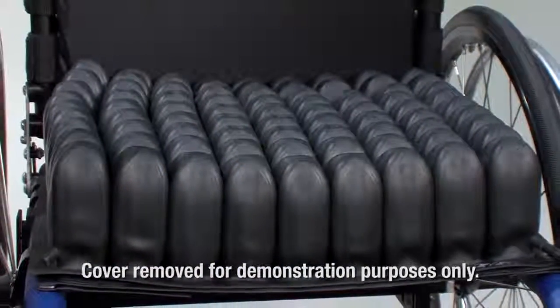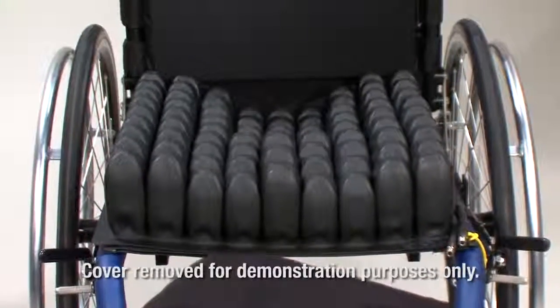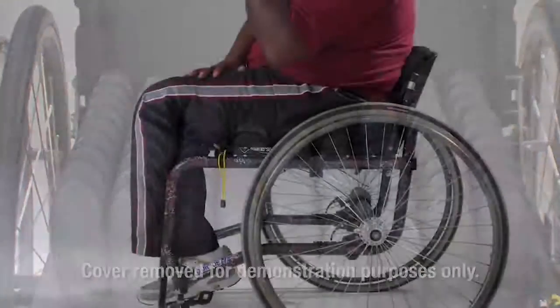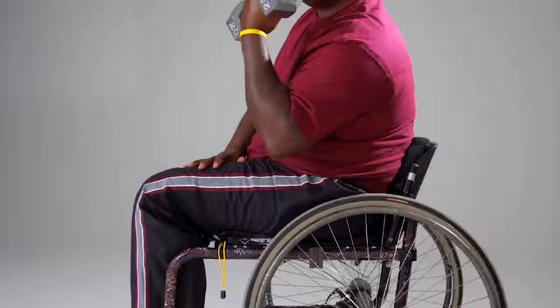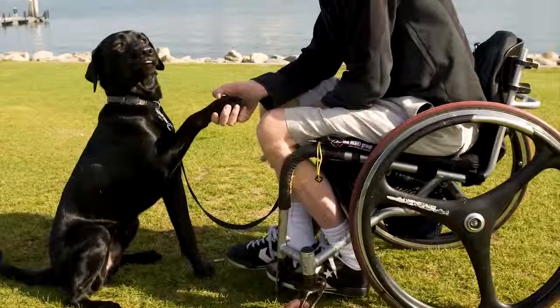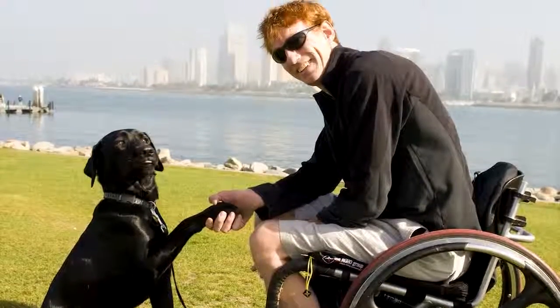Each cushion is an air-adjustable cellular design wheelchair support surface designed to conform to an individual's seated shape. These cushions are recommended for individuals who may have a history of or currently have skin breakdown. There is no weight limit with these cushions as long as the cushion is properly sized to the individual. Roho Incorporated recommends that a clinician such as a doctor or therapist experienced in seating and positioning be consulted to determine if the Roho dry flotation cushion is appropriate for the individual's particular seating needs.